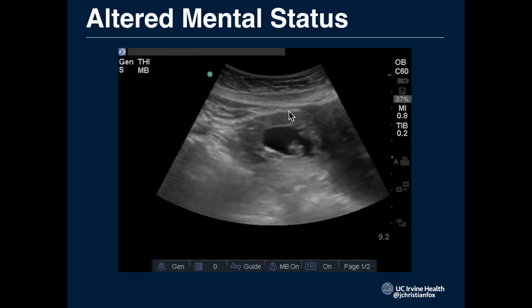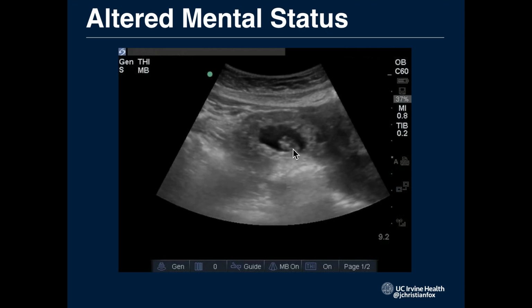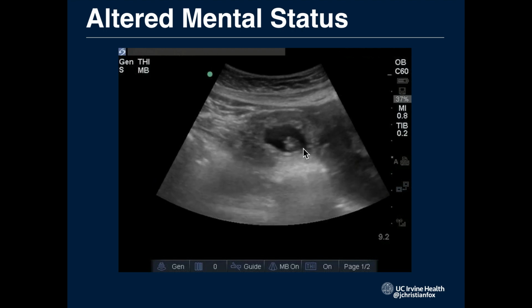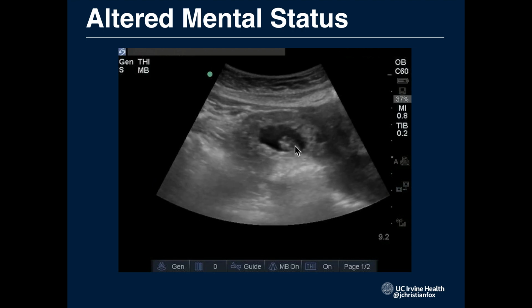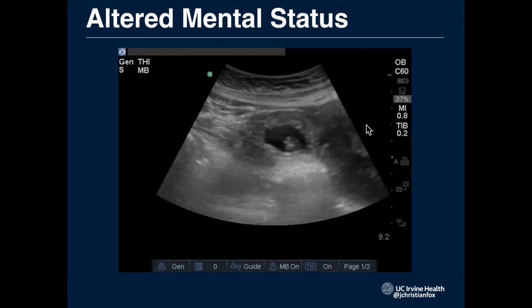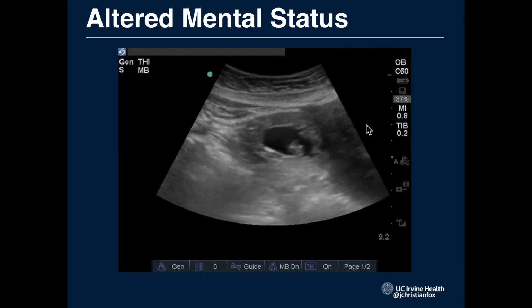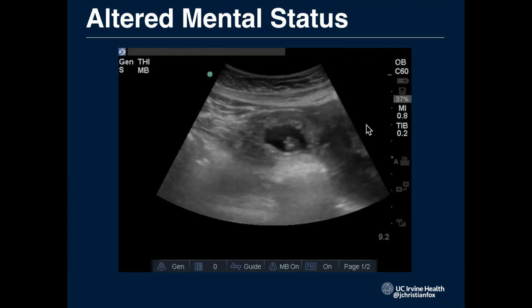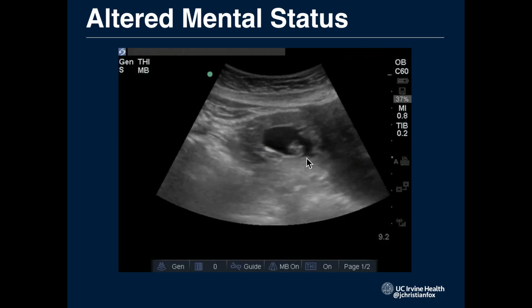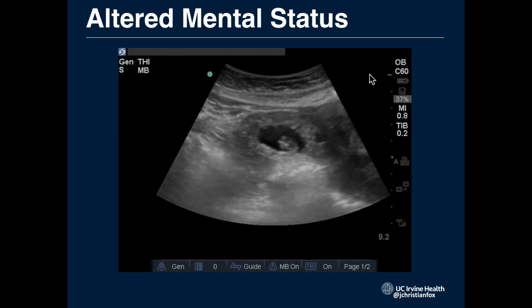And this is a mass that's outside of her uterus. There's a fetal pole in here. And so free fluid plus a mass in the pelvis with a fetal pole, thick ring of ectopic pregnancy. The uterus is actually over here, it's empty. And so lo and behold, we have another ruptured ectopic pregnancy, and we contact our friends in OBGYN and show them these images at the bedside and hang some blood and take her to the OR, and she survives.